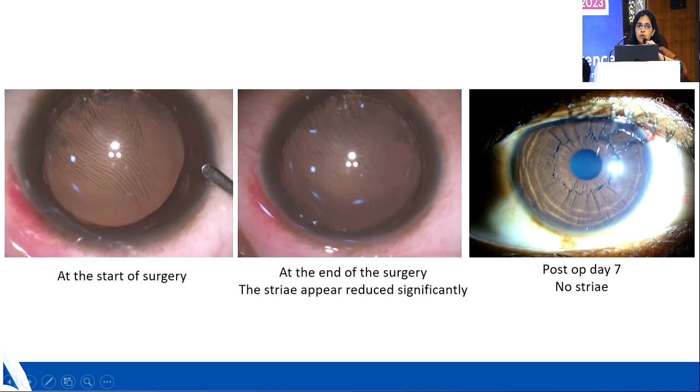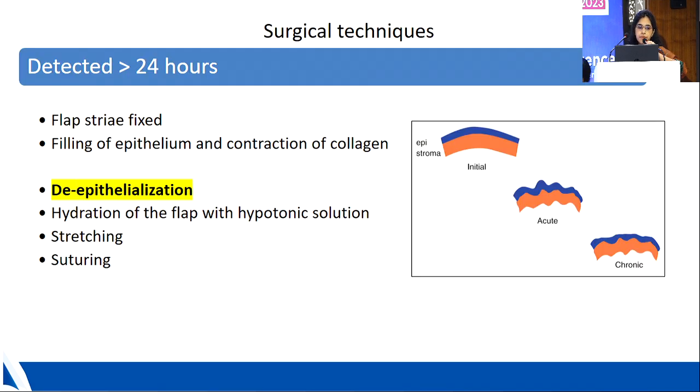Here we have to note that the striae may not completely resolve at the end of surgery, but if they are significantly lesser in number, then we can conclude. The same patient after day 7 is showing no striae and a completely clear flap.